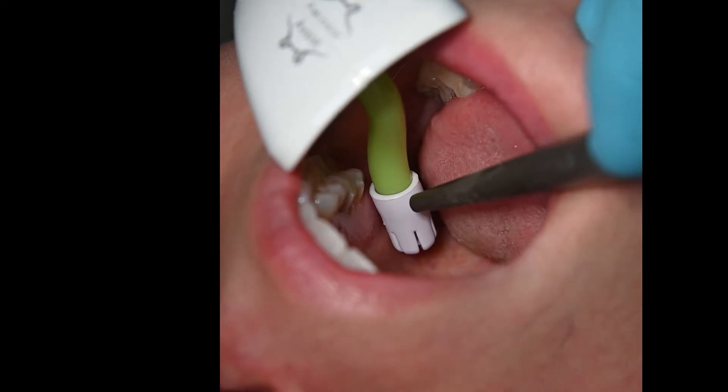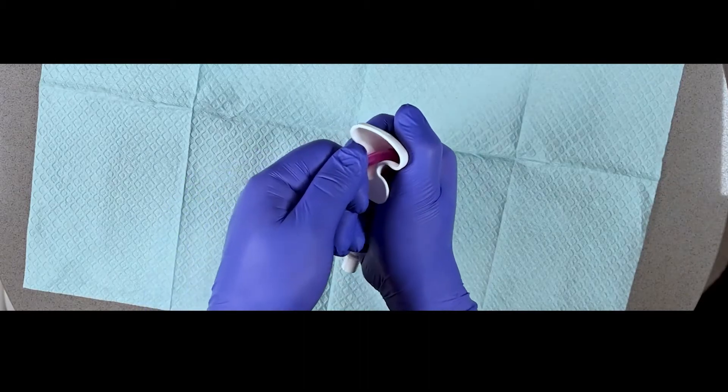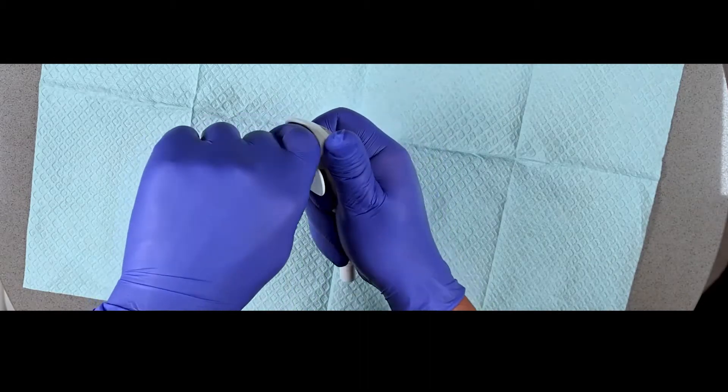If the length of the saliva ejector inside the Aerosol Cyst is too short or is uncomfortable, it is fully adjustable so that every patient can have an optimal experience.